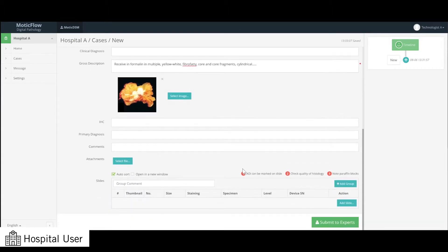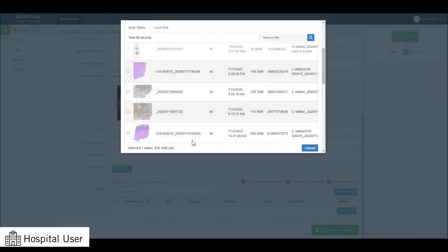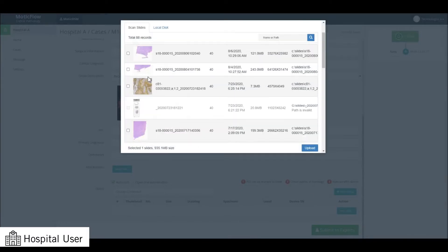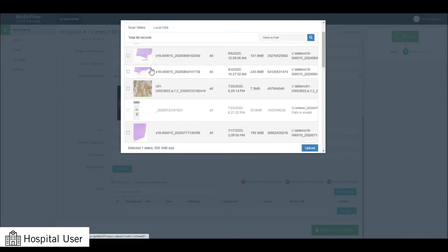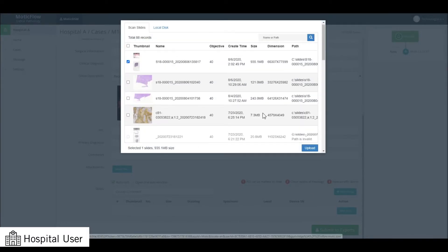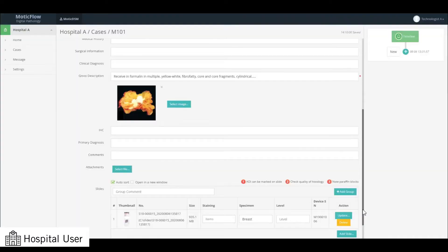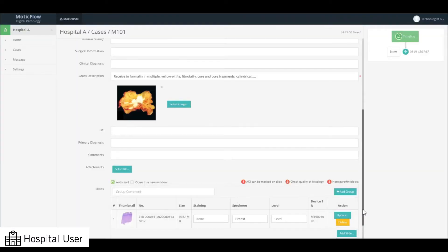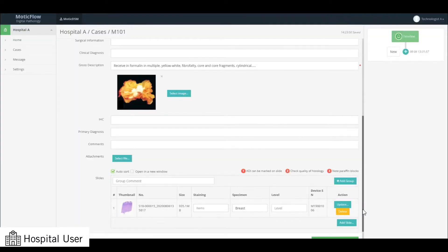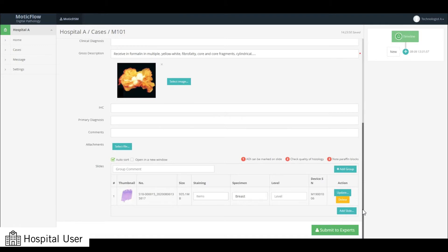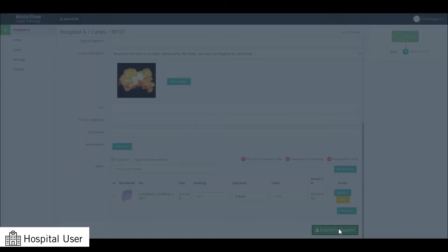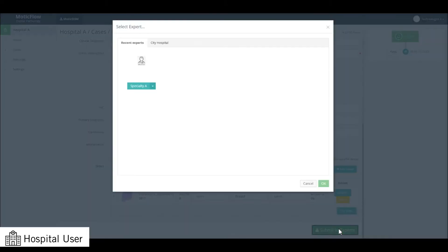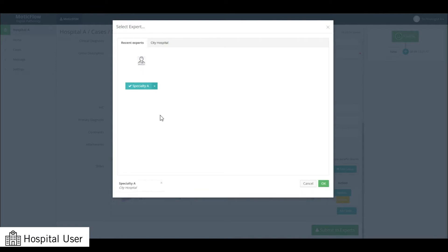Next, attach the scanned slide images from your scanner or local hard drive. Finally, assign the case to an expert in a relevant subspecialty before sending out the case.